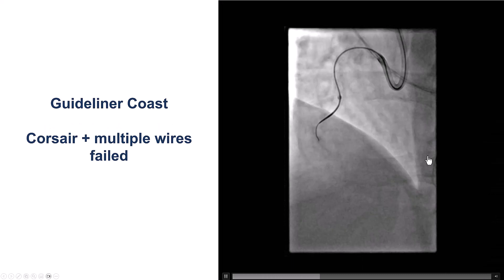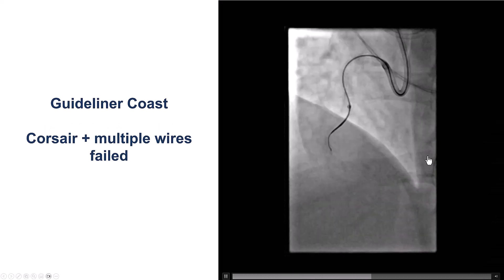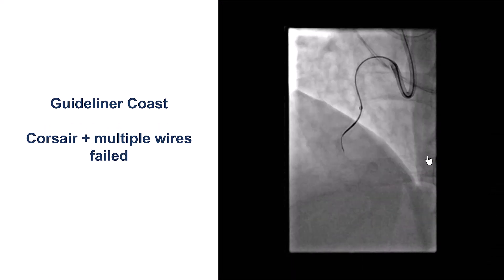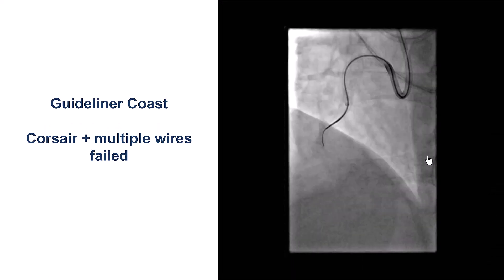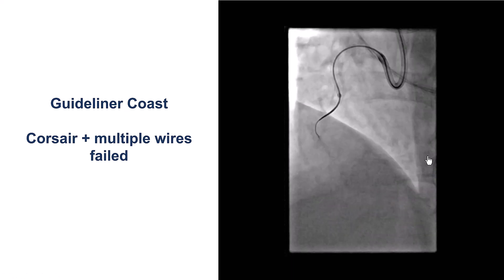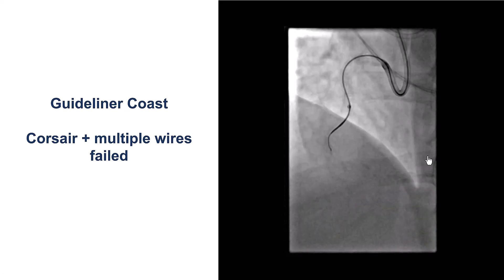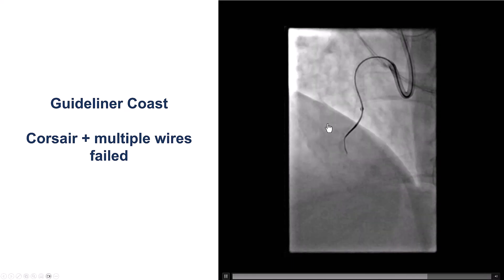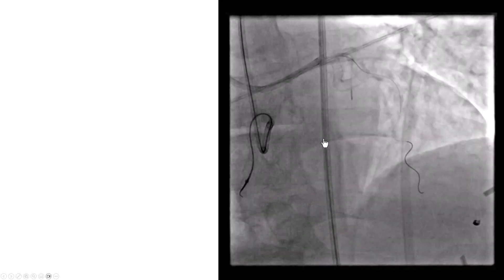We decided to start with antegrade wiring. We used an AL1 guide and a Corsair microcatheter and used multiple guide wires, but we were unable to cross through the mid-RCA CTO.